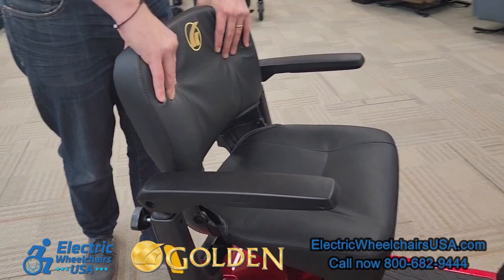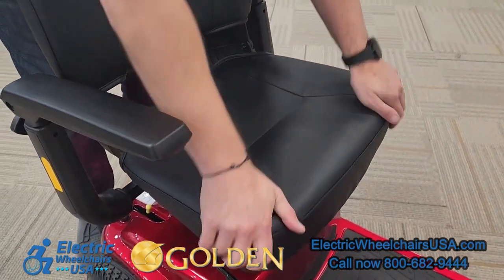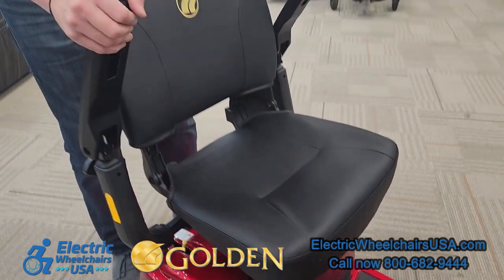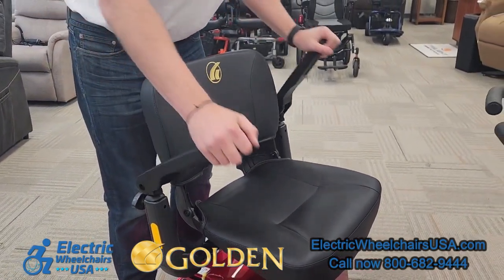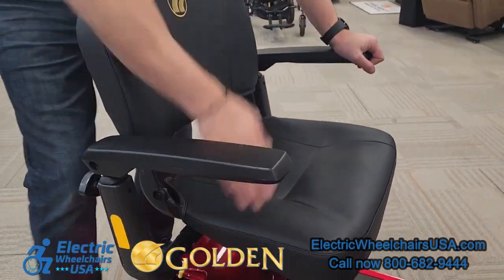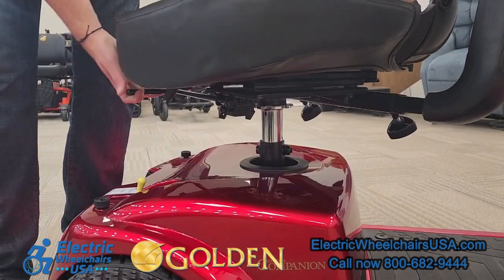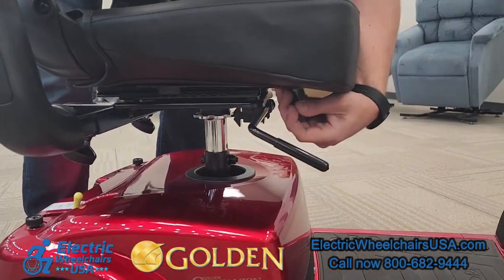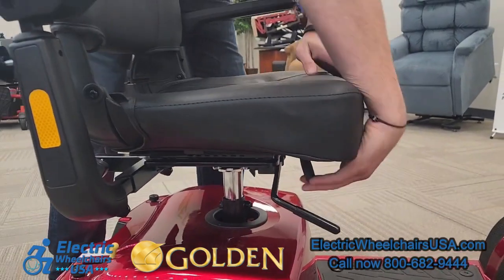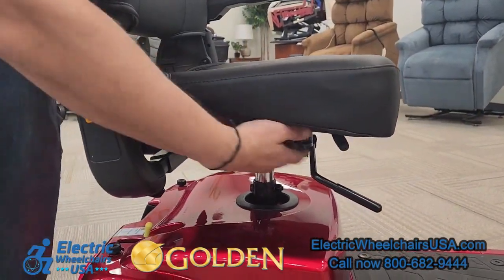The stadium-style seat on the Companion has a lot of padding and it's very comfortable. The armrests also flip up, and this lever on the bottom of the seat will allow the seat to swivel 360 degrees, so it's easy to get in and out of the chair. The seat is also adjustable forward or backwards so you can get to a nice comfortable position to get close to the tiller.